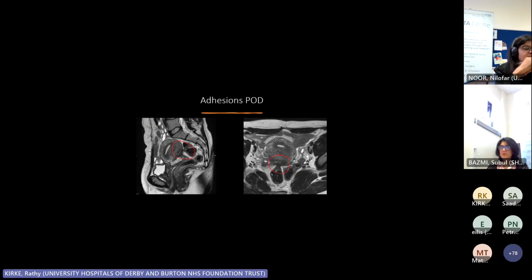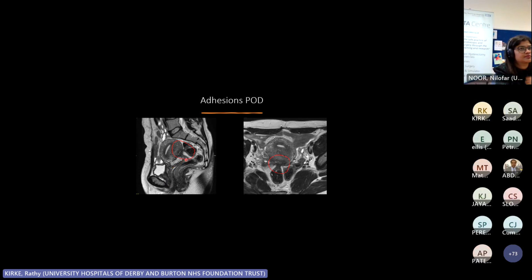So if you look at the disease in the posterior pelvis and the adhesions, think about this lady having an ultrasound. You've got the vaginal probe just up to that level over there. That's going to fan out all this area, and you're going to be able to look at the rectovaginal septum really, really well with an ultrasound. But if you look at the dynamic assessment, this is actually quite high up. This is between the sigmoid and the posterior aspect of the uterus.